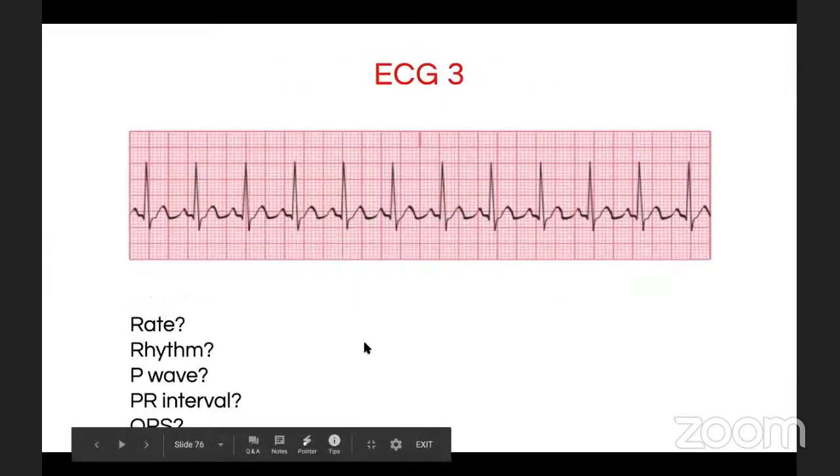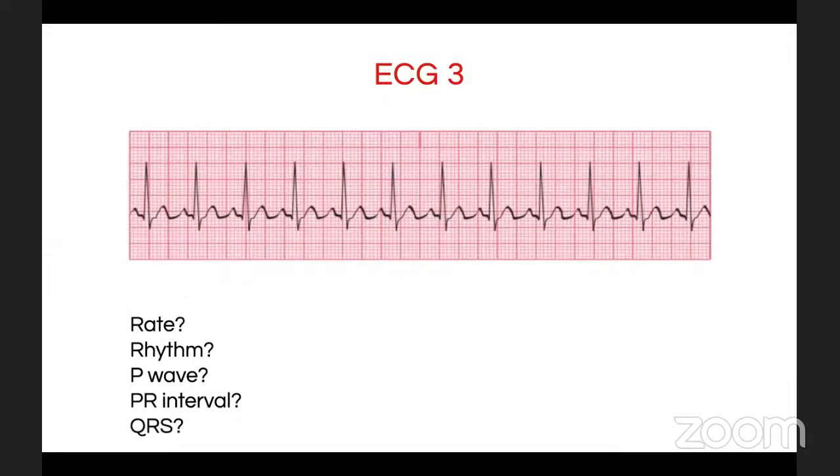يلا الحين أبيكم بعد تساعدوني لو سمحتوا. طيب أحس كثرت عليكم شوي. طيب خلينا نشوف هنا، خلينا ناخذ أوضح ثنتين for example هذه أوكي هذه الآر وهذه الآر.